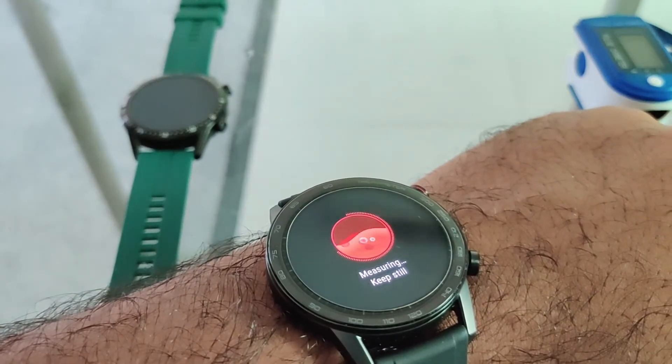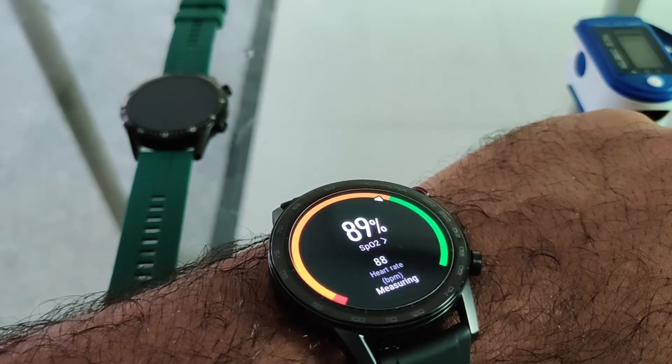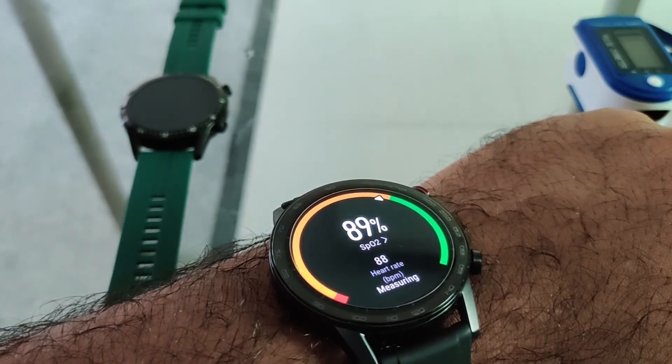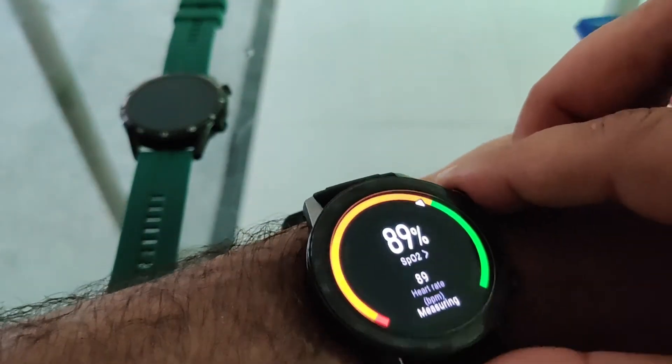Once you have the readings, you can always see the levels. This one shows an inaccurate result. Let's quickly fasten the belt and check for the readings again.